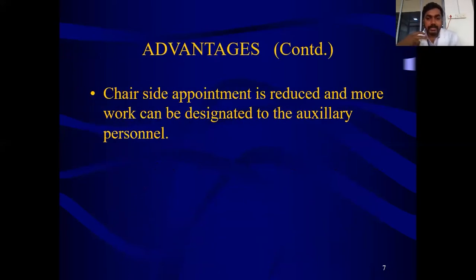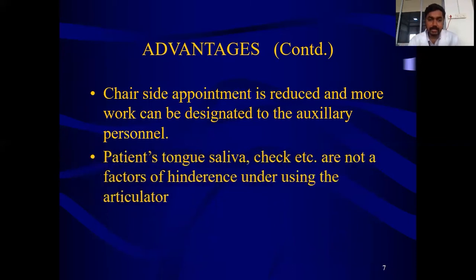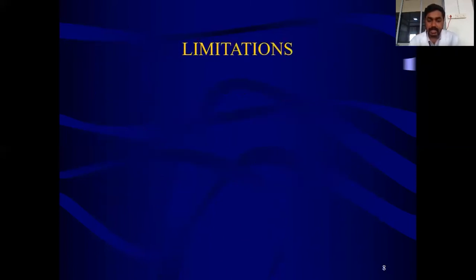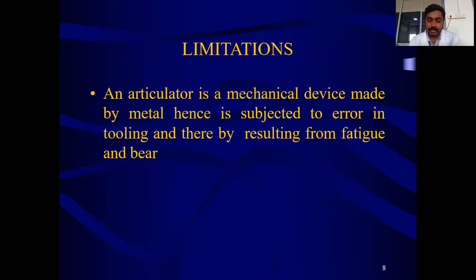Chairside appointment is reduced and more work can be delegated to the auxiliary personnel. So before the patient comes to the chair itself, we will be able to complete the work. In that way, we will be able to reduce the chairside appointment time. Then the patient's tongue, saliva, cheek, etc. are not factors of hindrance when using this articulator.